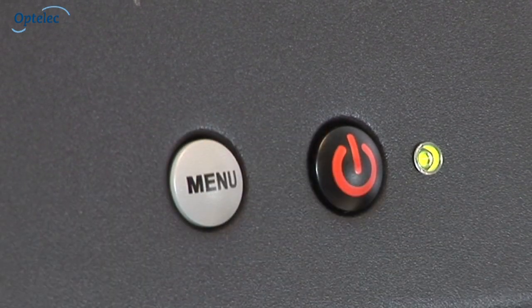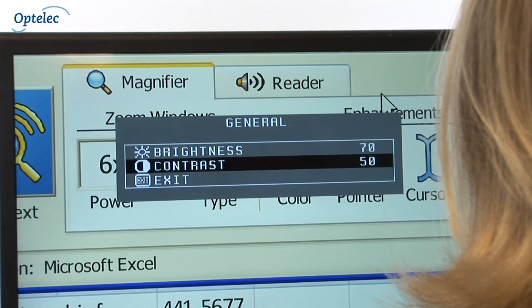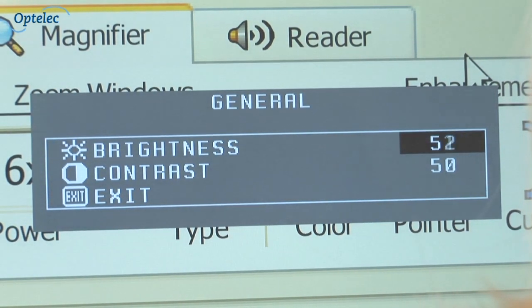Press the menu button to access the large font menu. This allows you to adjust the color, brightness, and contrast settings for both the video magnifier and computer images individually.